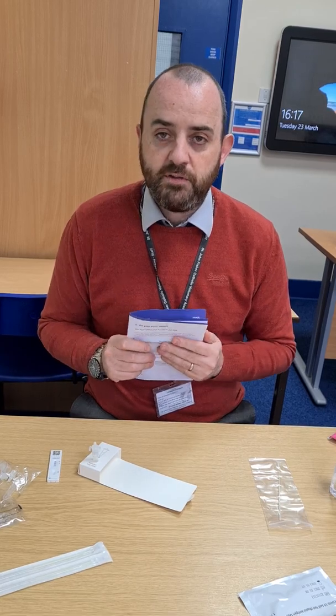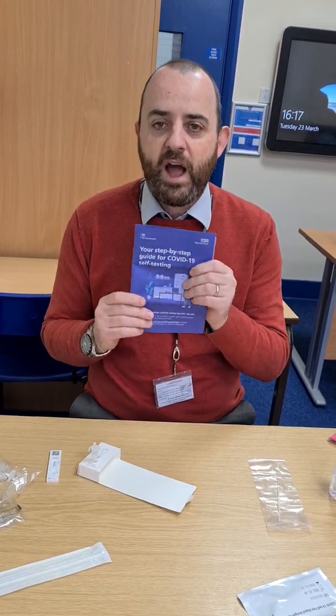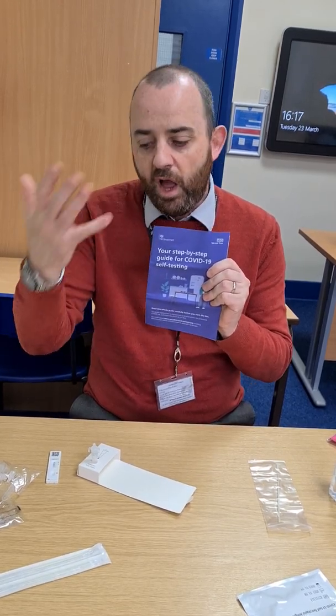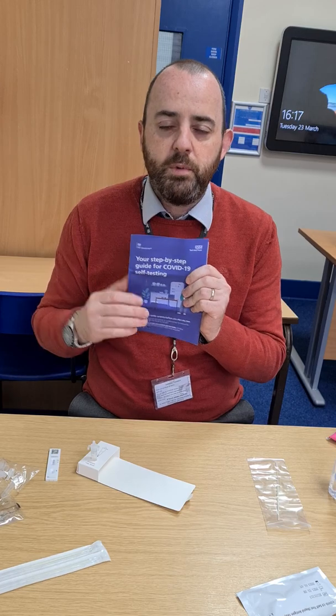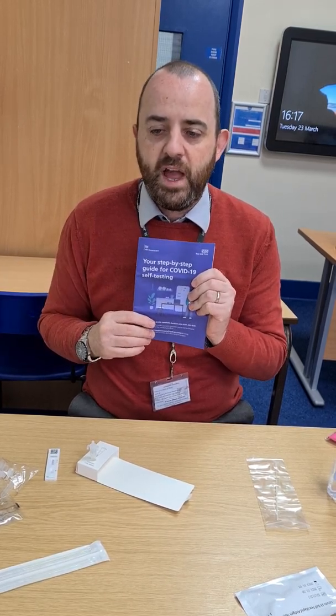Good luck with completing these at home. The booklet has a step-by-step set of instructions, and this video will also be available on the school website for you to watch again if you forget any of the steps.